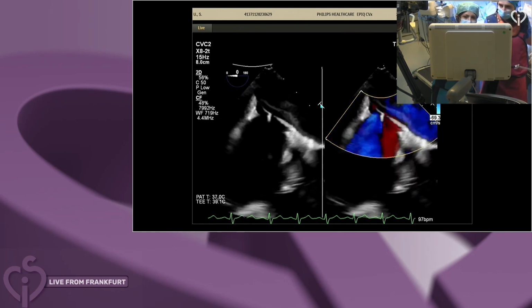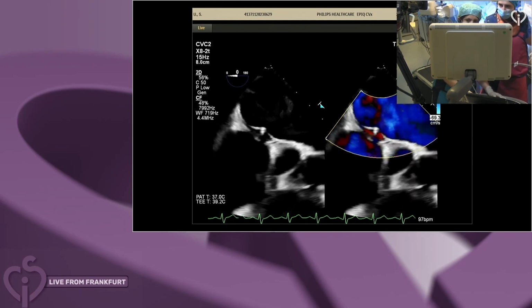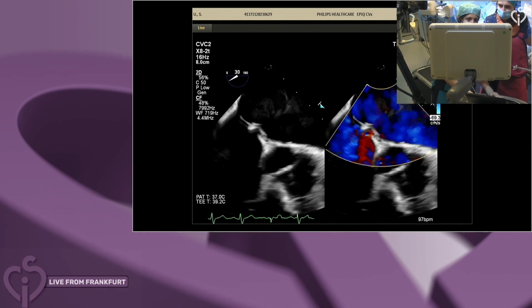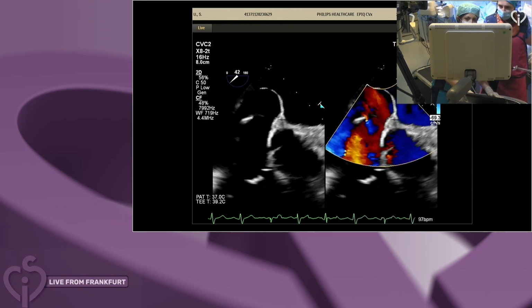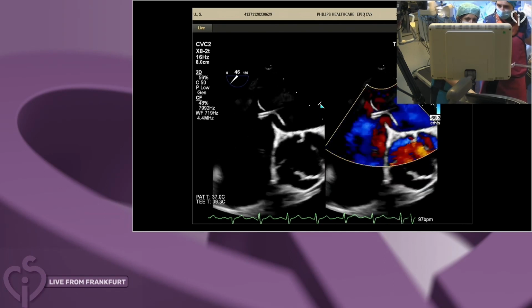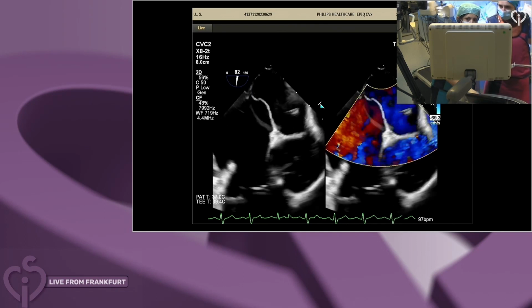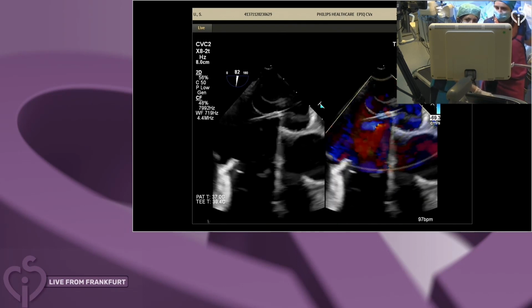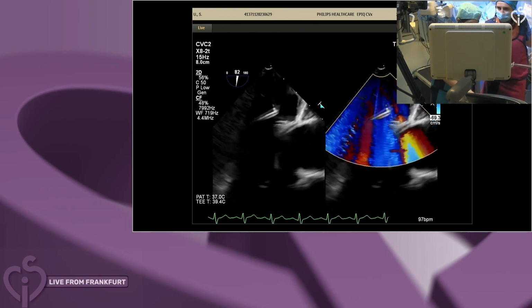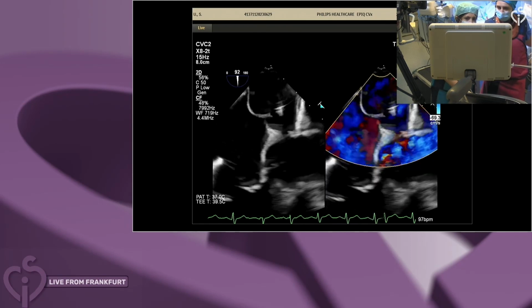Then we'll move through the machine and go from 0, looking at the color on the septum. Obviously, we'd push up and down as well, just to make sure: 0, high, mid, and low. Then we're going to look at the fossa here. Can't see anything else exciting at the moment, except for the aneurysmal septum and the PFO. Other than the aneurysmal septum, the attachments of the primum septum are pretty sturdy, and they're coming to about 12 millimeters.